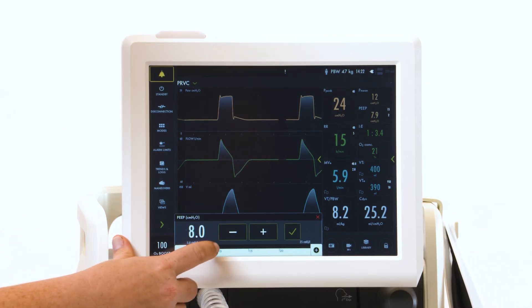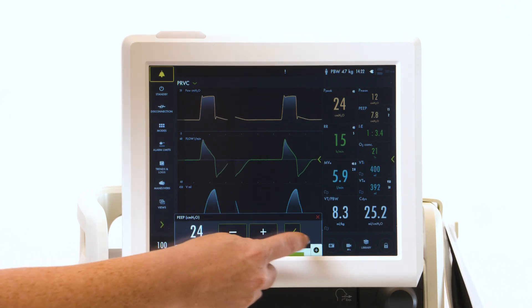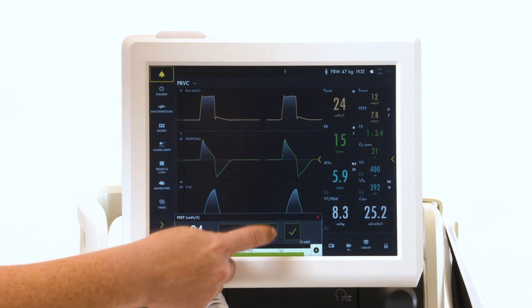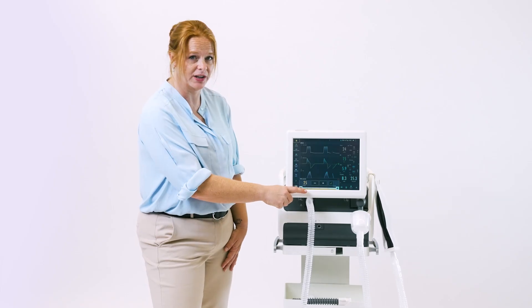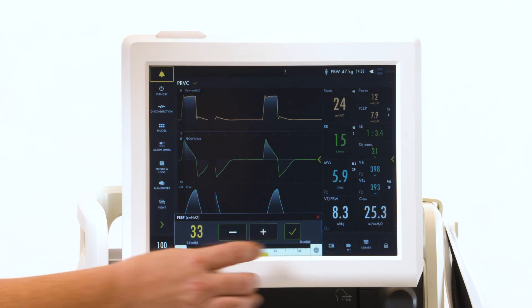Touch a setting. To make changes, you can slide along the bar or add and subtract. When you move beyond the default, the scale will turn yellow, alerting you. Press the plus sign if you would like to go beyond that.